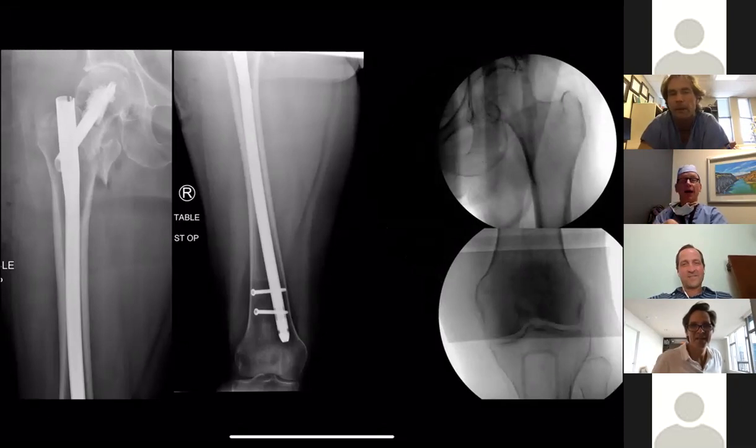But so Greg, if you're present when you're putting those distal locks in, right, you're also going to appreciate that your hand is either doing this or doing that, right? Yeah, for sure. So I changed the position of the distal segment, or the nail, in order to get a more reasonable view. Now, I don't know if that's right or not. I'll let you know. I'm going to get a CT version study in order to find out how different she is than her other side.